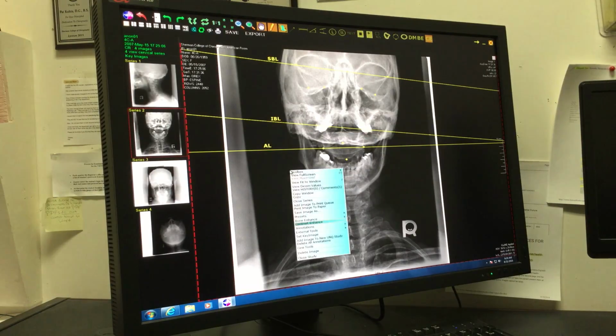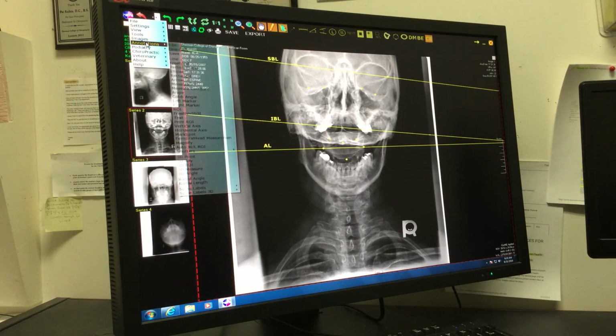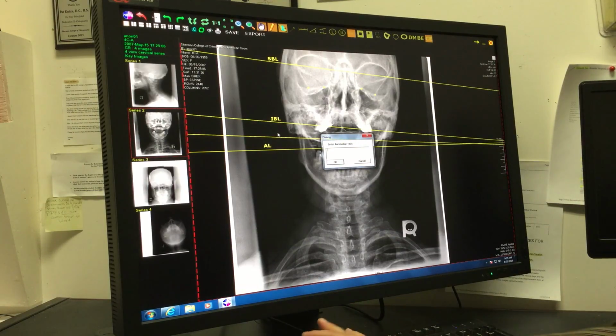We also need to make sure that we mark our spots on the MIT of the condyle, both right and left side. And let's create our superior wedge line through the MIT points. And let's get a text box and label this SWL for superior wedge line.